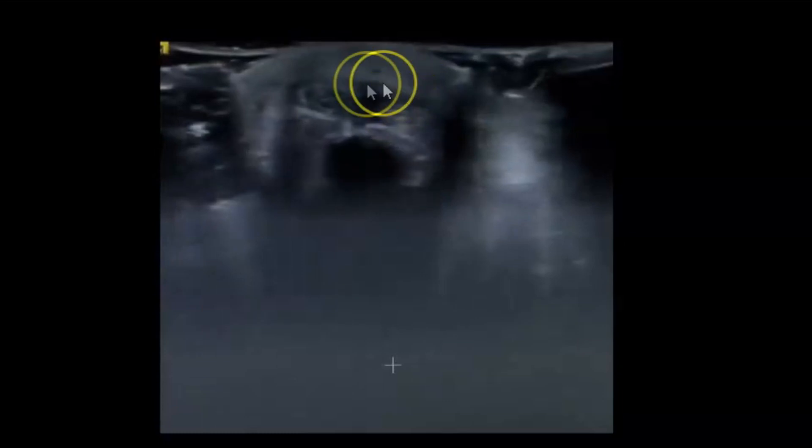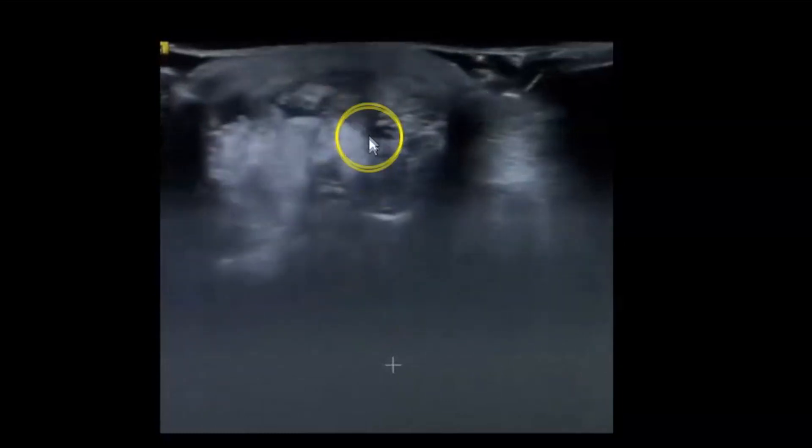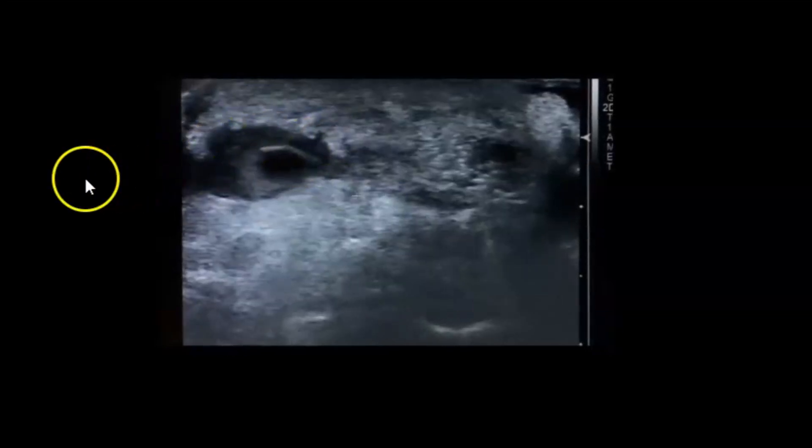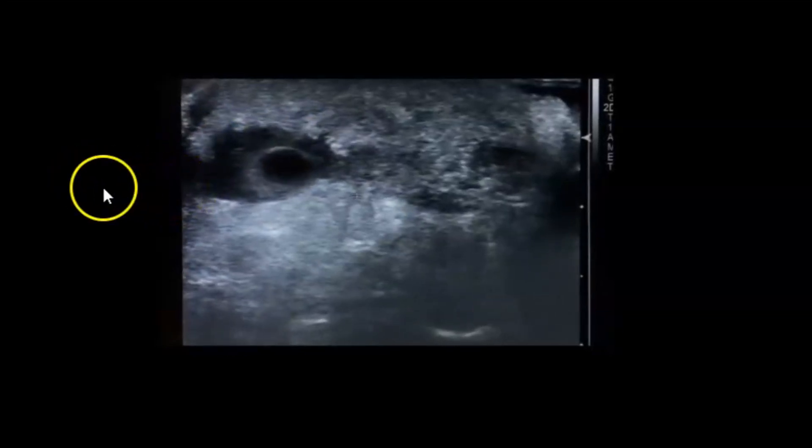Here we have a clip from a tendon where somebody had a lacerating injury to the Achilles area. That's the Achilles here. There's a little bit too much depth in this image — you could decrease that — but you can also see on this side there was a pulsatile mass consistent with a pseudoaneurysm adjacent to the Achilles tendon.